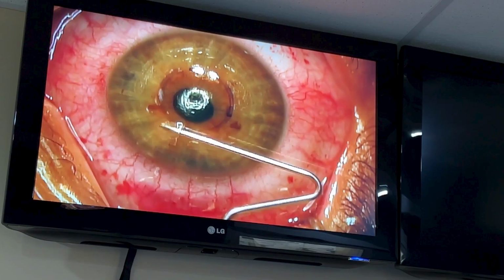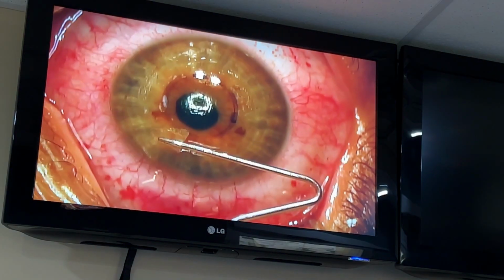And then the side cut. The side cut is made about 15 degrees off from where the edge angle is gonna be, again, this is given to you, so that the edge angle of your inlay is nowhere near that side cut. Otherwise, it might pucker a little bit. So 15 degrees is a reasonable amount. I use 30 personally. So I just move that edge angle a little bit over just so that the inlay is not near it. 15 seems fine.